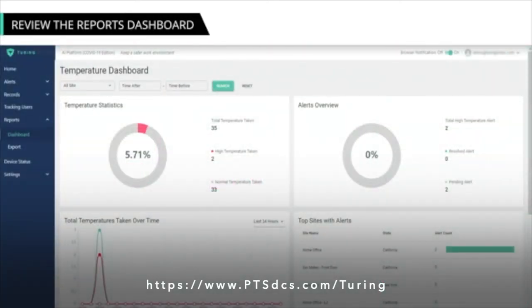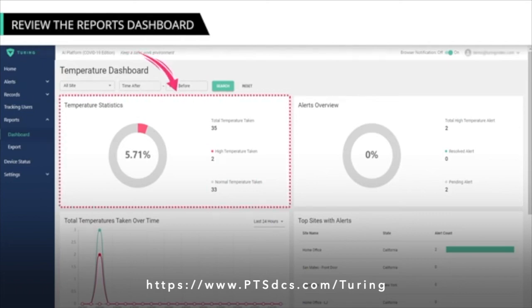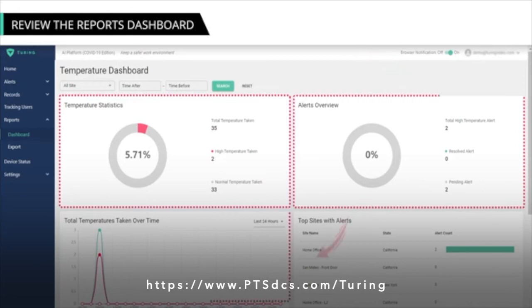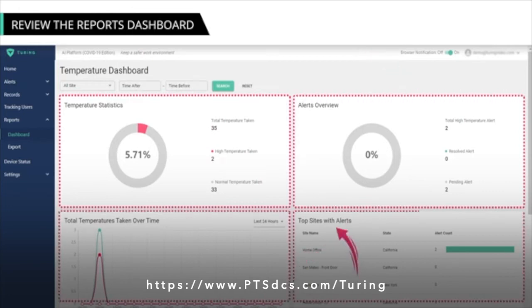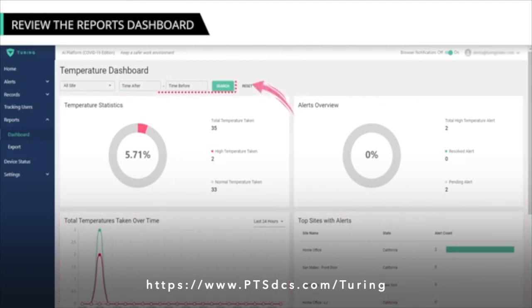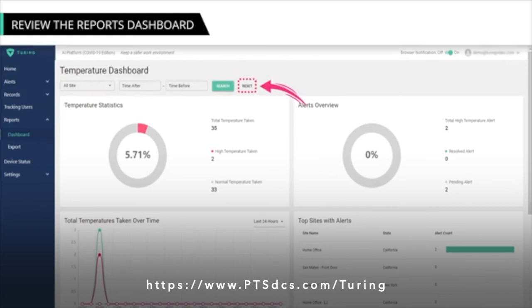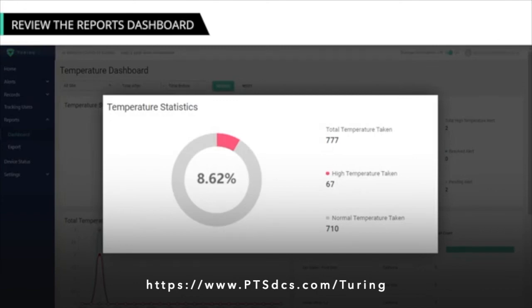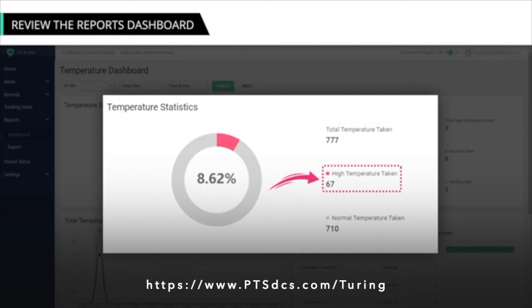The Temperature Dashboard page offers four different statistical views for all sites combined: temperature statistics, alerts overview, total temperatures taken over time, and top sites with alerts. You can also use the filters to view data for a specific site and time. Note that clicking the Reset link will set the dashboard back to default settings. The Temperature Statistics graph shows all the temperatures taken at a specific site or all sites, how many are high, and how many are normal.